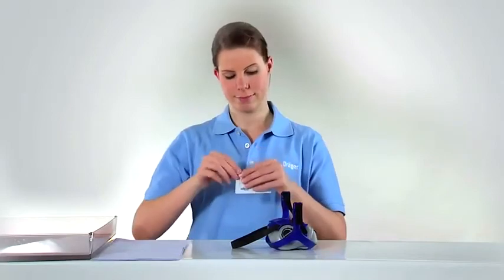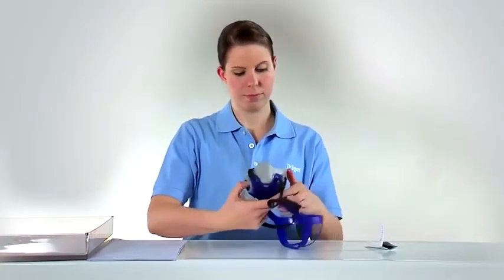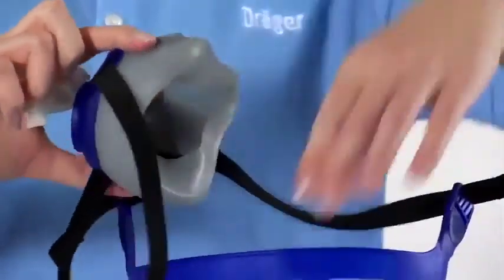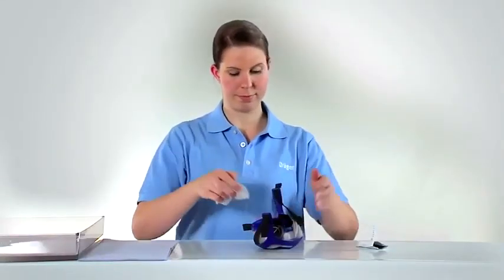When your equipment needs a quick clean, for example in training situations or during breaks, you can use an alcohol-free respirator wipe. Please note that this does not replace cleaning procedures described in the IFU. This cleaning method should only be used temporarily in situations where the mask is used by one individual.